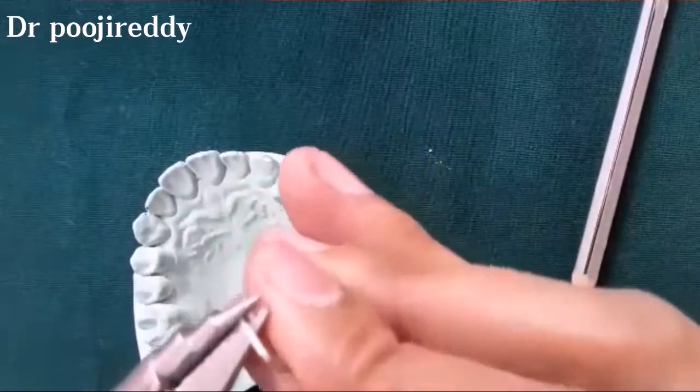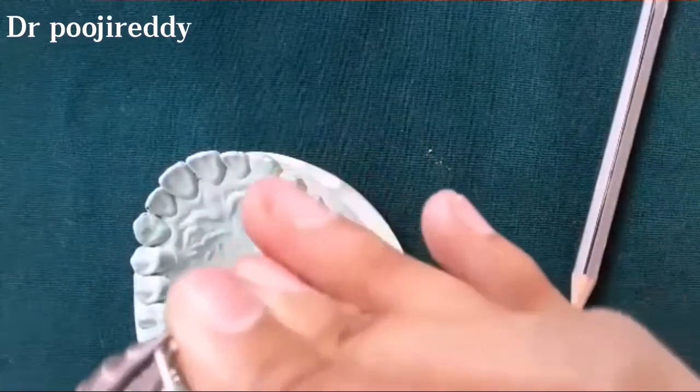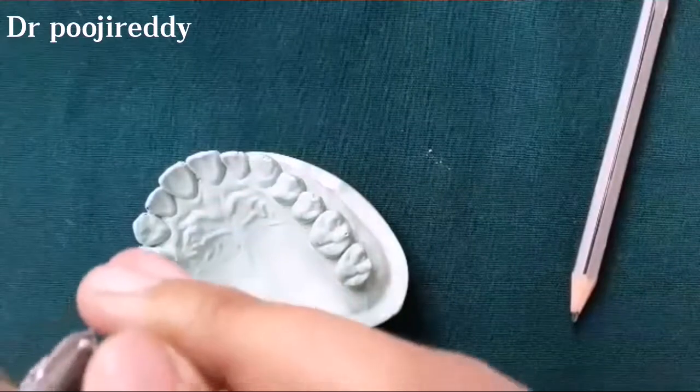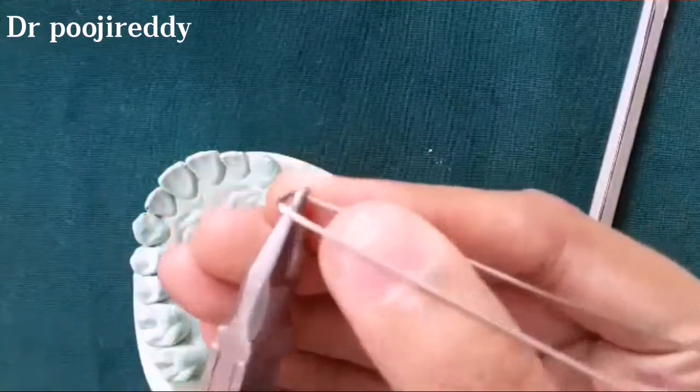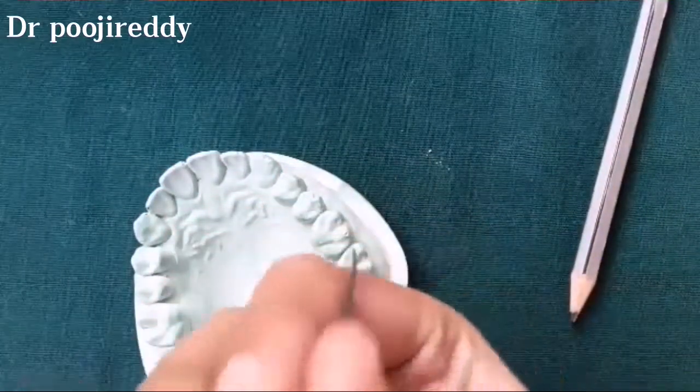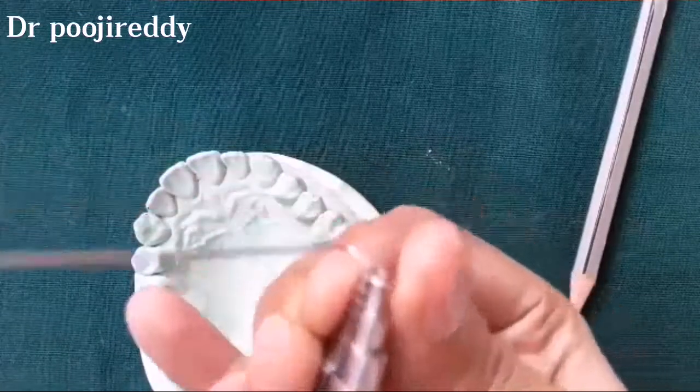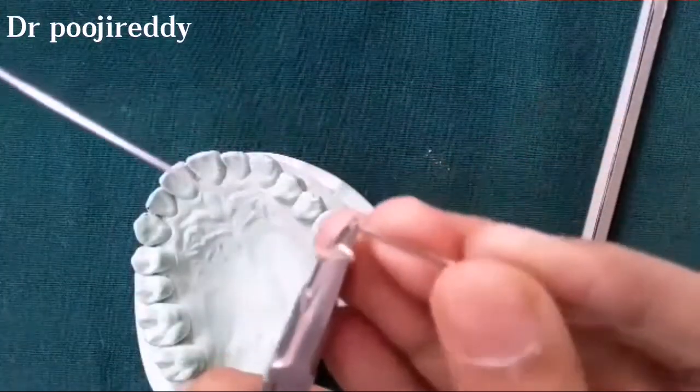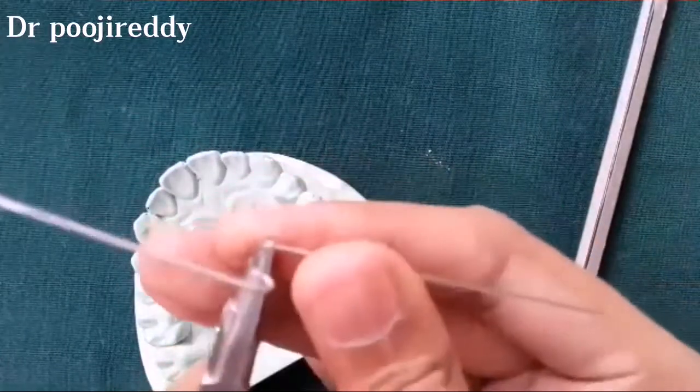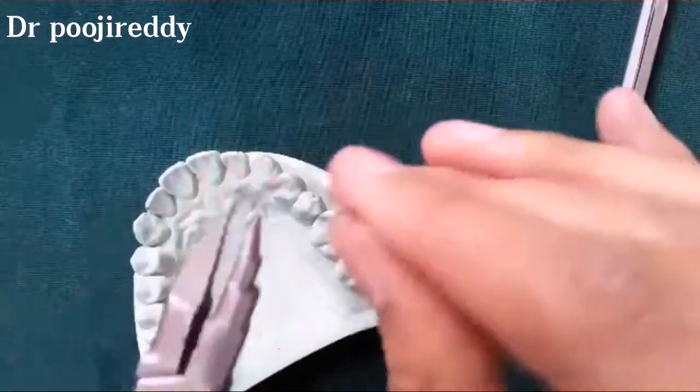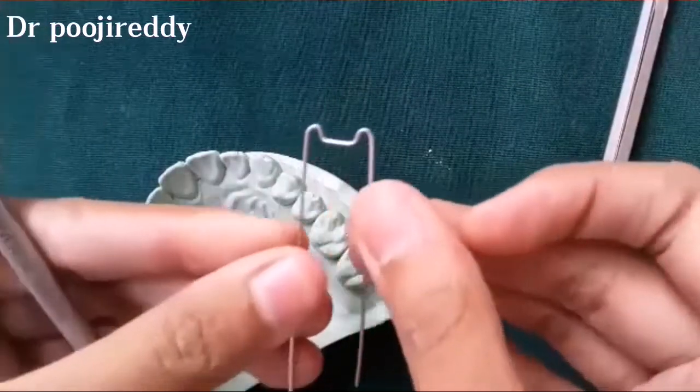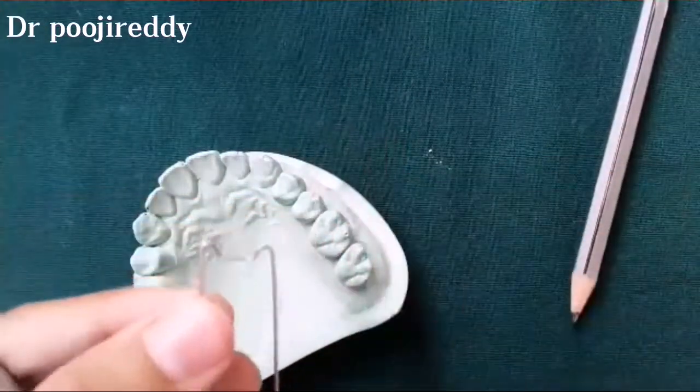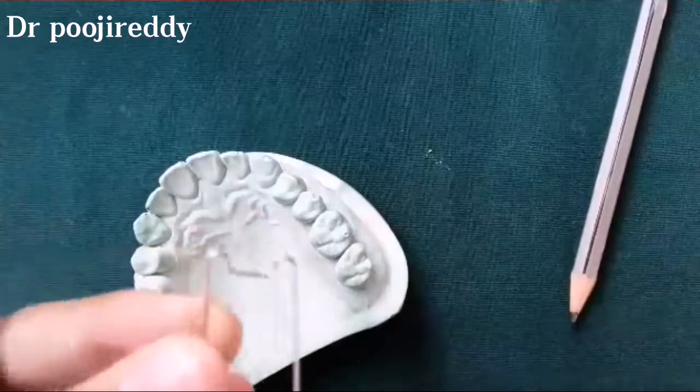And now the beak of the universal plier is placed on the outer side close to the bridge of the Adams clasp and bend with the round beak, round side of the universal plier. Surround the orthodontic wire around the round side of the universal plier so that the wire will be bent in the shape of U, and this forms the arrowhead.